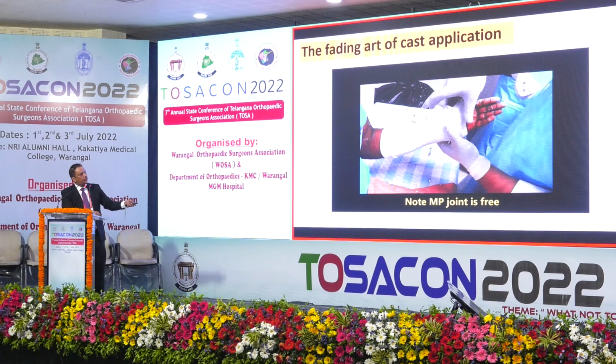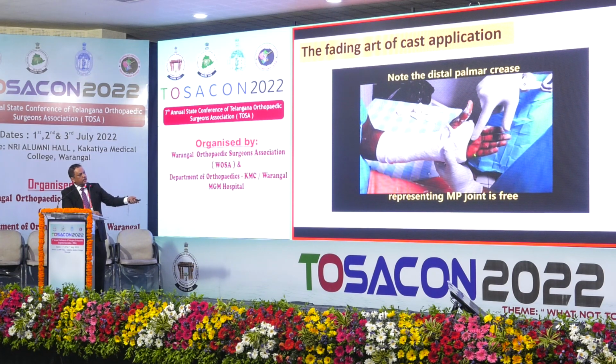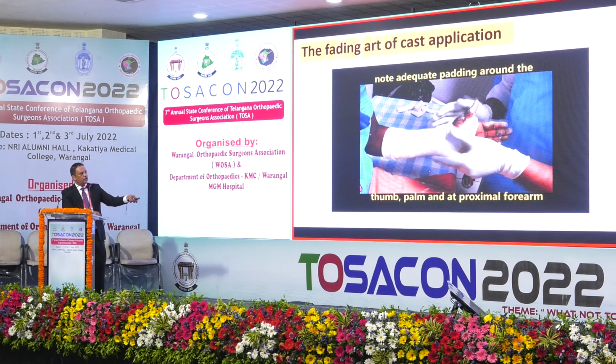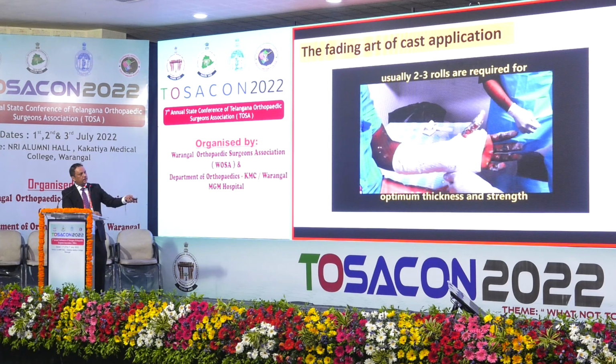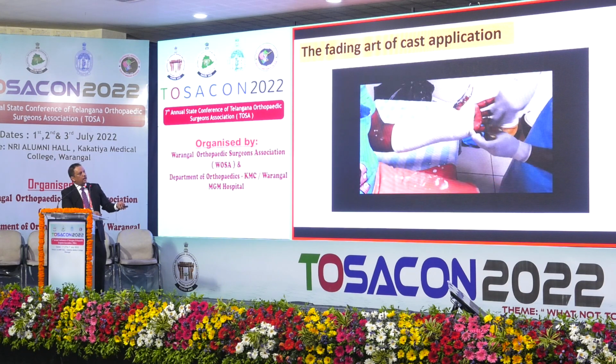As I said, fold all the way till here, and make sure the palmar crease is completely free so that the MCP joints are completely free. So these are all small steps, but very, very important steps for us to learn and to keep teaching our juniors and the younger generation.